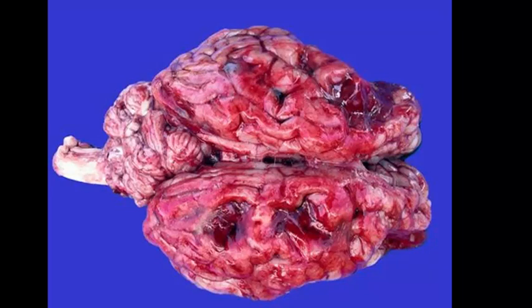And finally, question number 10. This is tissue from an ox. What is the most likely cause of this lesion? A, bovine herpesvirus 5. B, excessive dietary sulfur. C, Histophilus somni. Or D, Aspergillus fumigatus. Most likely cause of this lesion. Okay, your time is up.